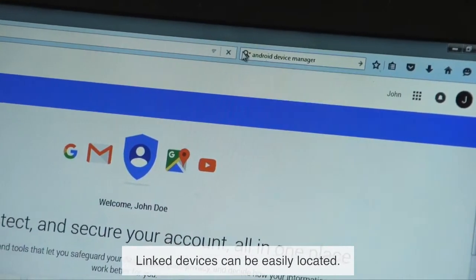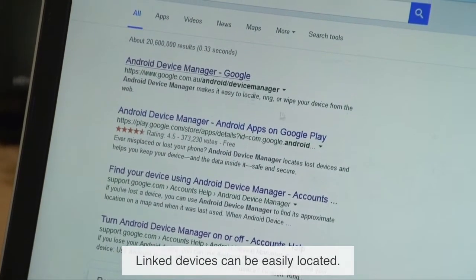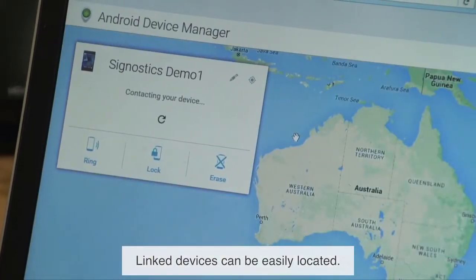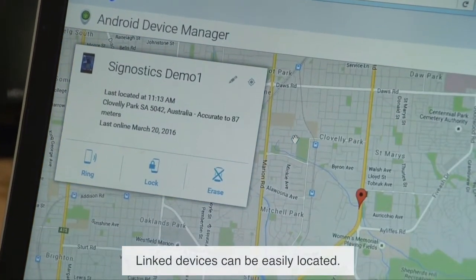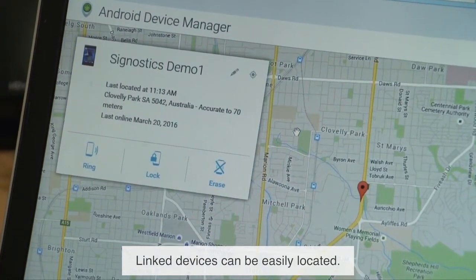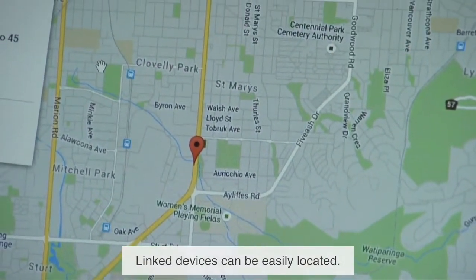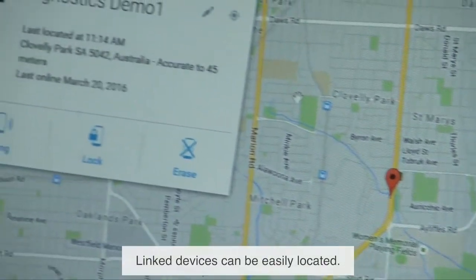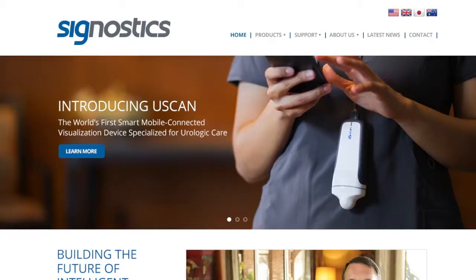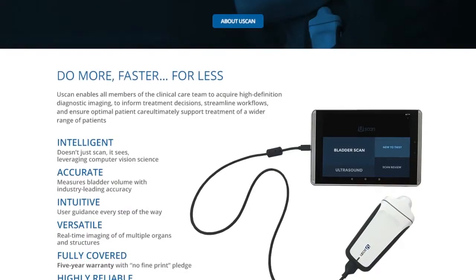Now you should be able to use any device or browser to check the location of the linked devices. Log in to your Google account on any device and use the Android device manager. This feature is especially useful to find devices left at home patients' locations. However, even within a hospital, the device can be remotely set to ring at full volume for five minutes. Be sure to visit the Cygnostics website for more educational tutorials and information on the uScan.